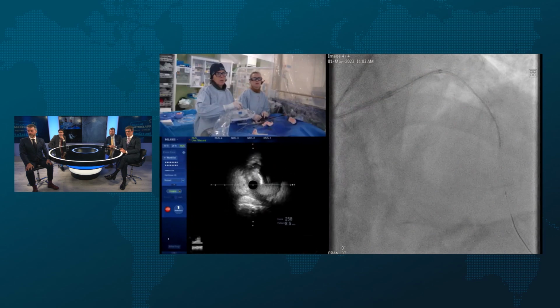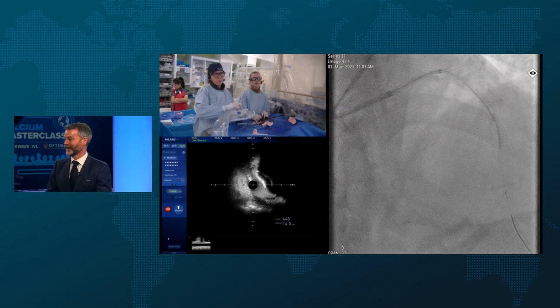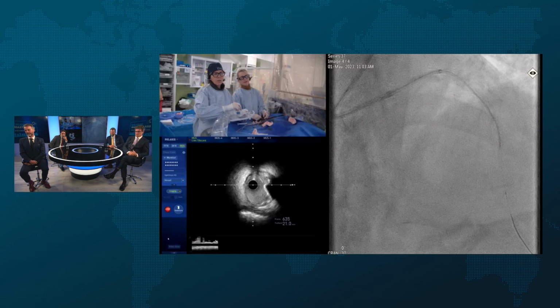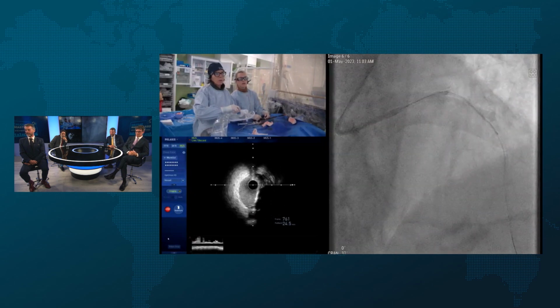Look at that though. That'll push though. It's certainly a well-chosen case for nodular calcium. Absolutely. Can you just fluoro and show us where the nodule is, Margaret? Can you show us where that was? Fluoro and show us where the nodule was, where you are on the X-ray? There you go. Yeah, around that bend. It was just on that bend.